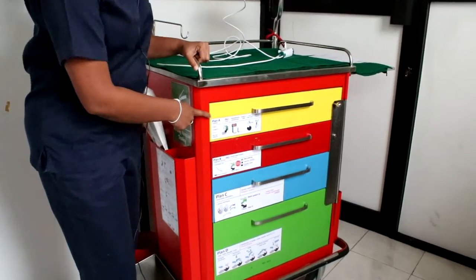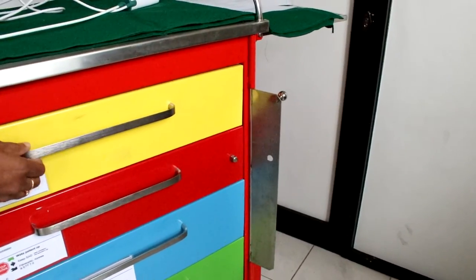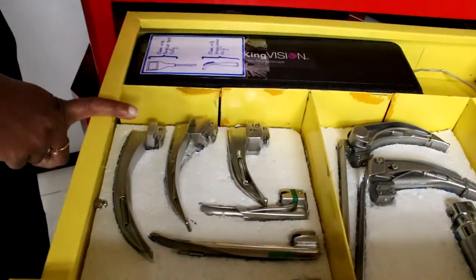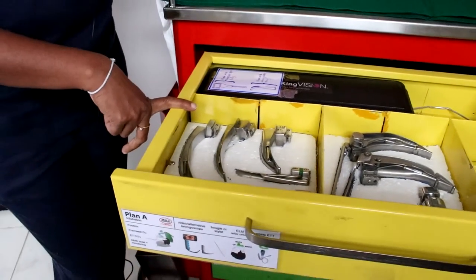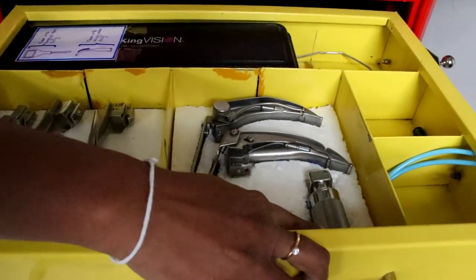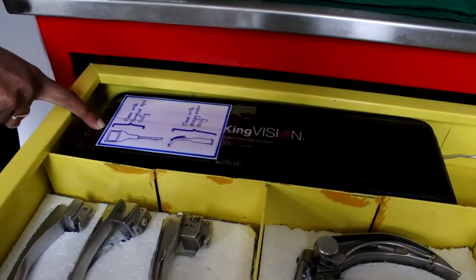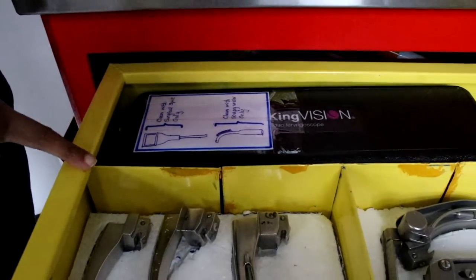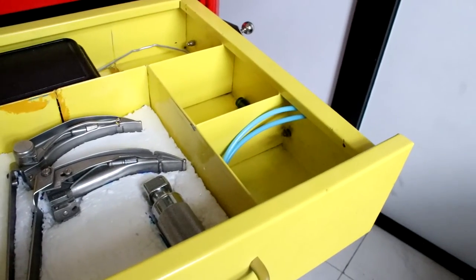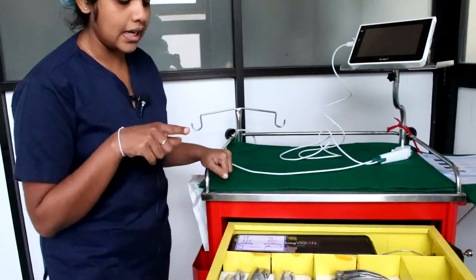Plan A is an attempt at intubation. In a difficult intubation you will need different sizes of laryngoscope blades — these are the Macintosh blades, Miller blades, and McCoy blade — along with a short handle. You also have the video laryngoscope here, a stilette, and an extra bougie. All these equipment can be used in an attempt to intubate the patient in the first go in Plan A.